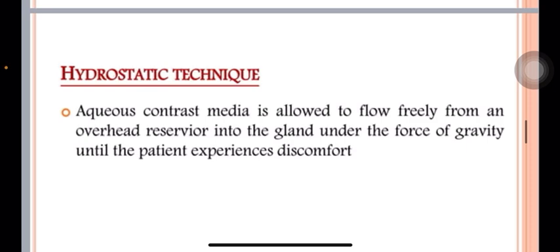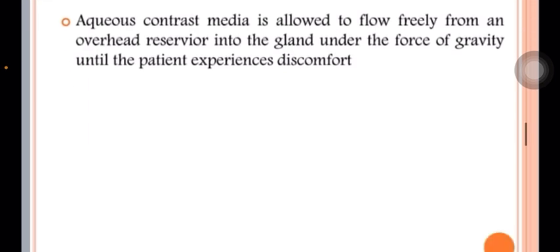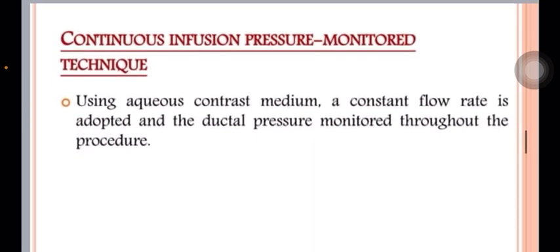Hydrostatic pressure. Aqueous contrast medium is allowed to flow freely from an overhead reservoir into the gland under the force of gravity until the patient experiences discomfort. In continuous infusion pressure monitored method, a constant flow rate is adopted and the ductal pressure is monitored throughout the procedure.